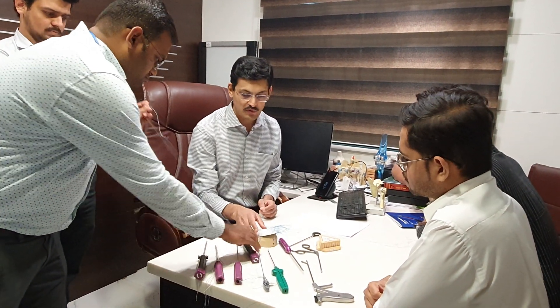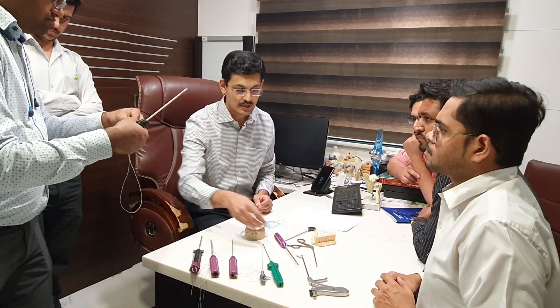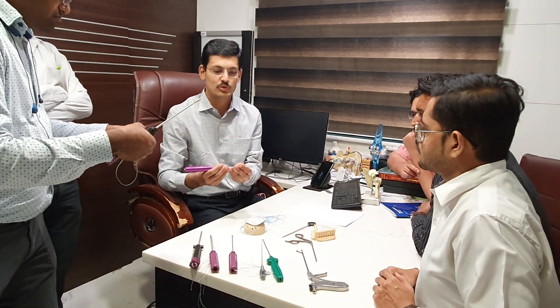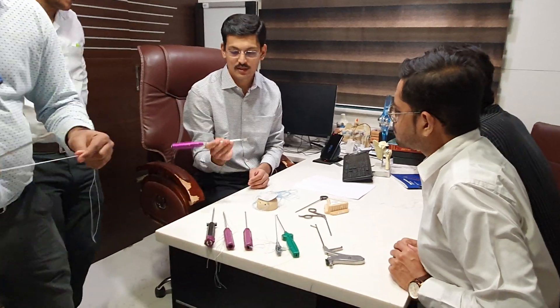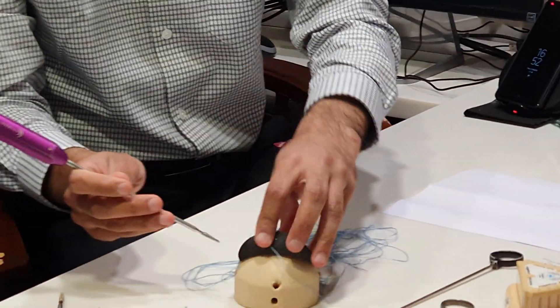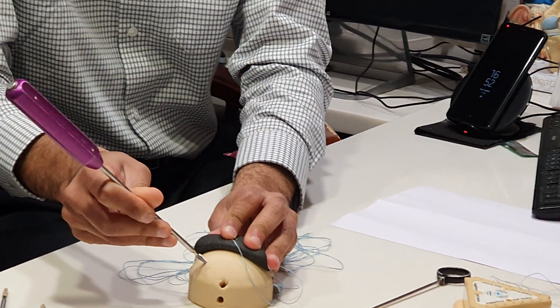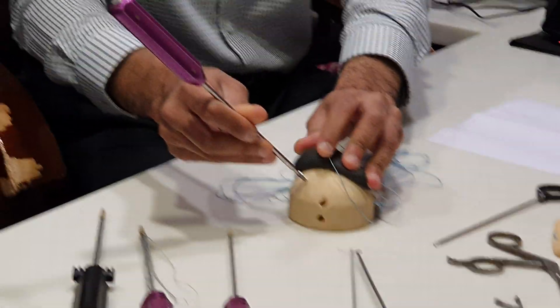Now we will show how to insert the different threads. This is an inserter — the Quattro medial row anchor usually comes with the inserter. When you have to insert it, you insert it with the hole, and then you need to tap it in.